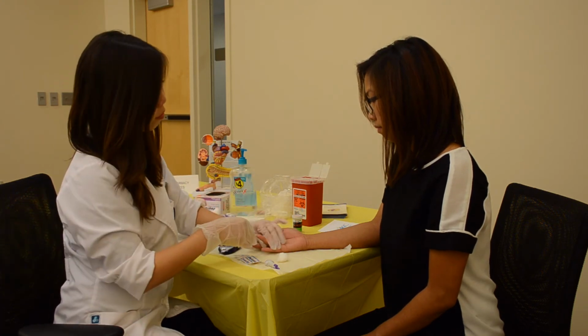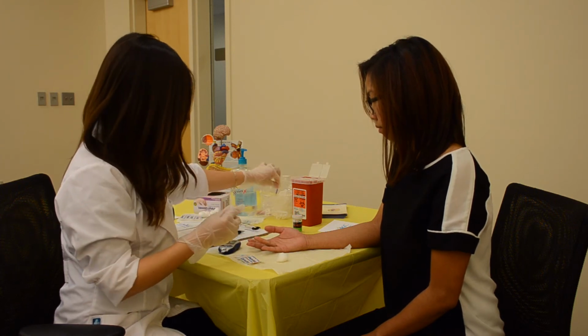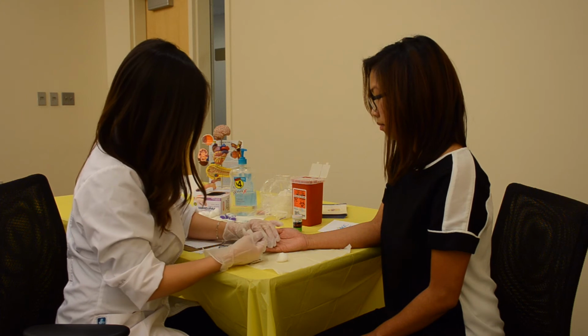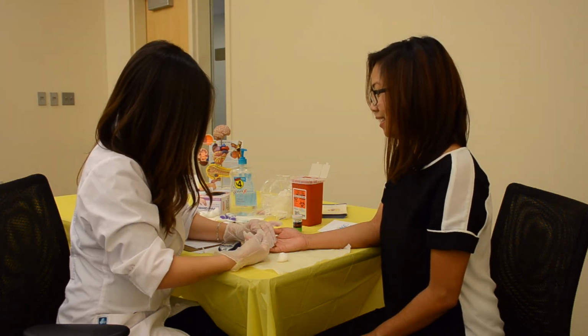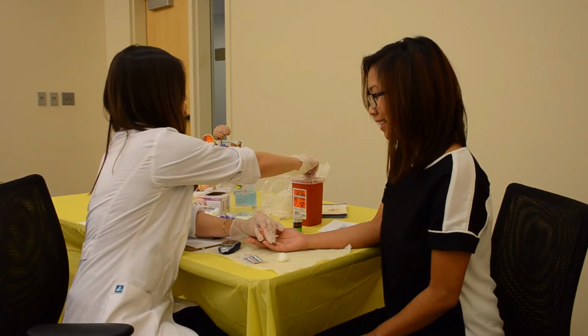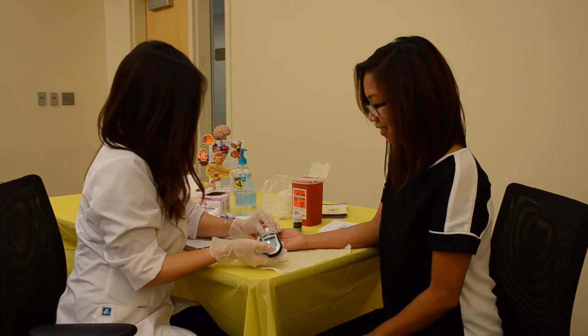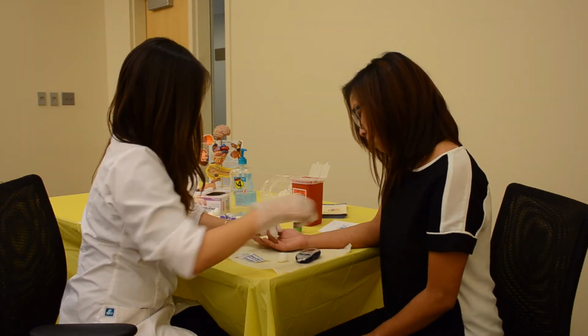Let the patient know they will feel a little stick. Milk the finger if you need to in order to get plenty of blood flow to the tip. Apply pressure and prick the edge of the fingertip rather than the pad of the finger. This will minimize patient discomfort because there are fewer nerve endings on the edges.